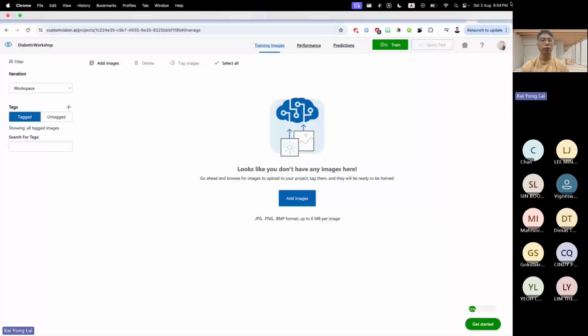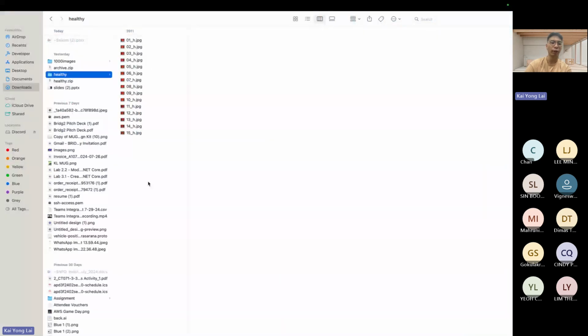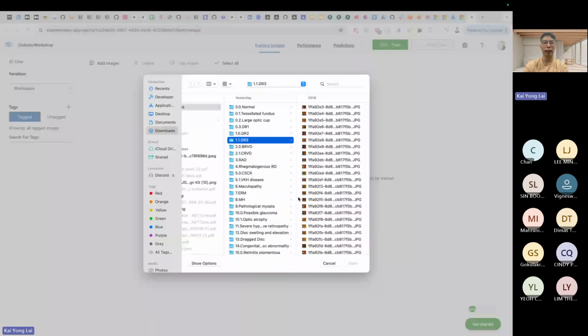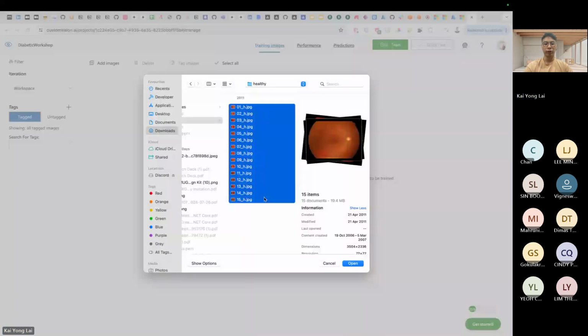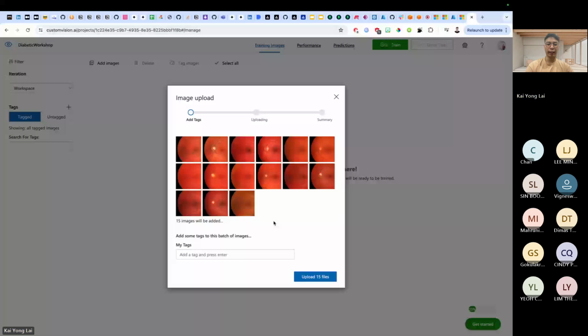Okay. All right. Cool. So I hope you guys already have the data, but if you don't have all of it yet, you can follow once you have it. But I think the healthy data file is very small, so I hope you guys already have that. So the first thing we are going to do here is put in our healthy eyeballs data. So just unzip the zip file, then place all of the healthy eyeballs data here. Okay, so you can see once the images are added, we are going to give it a tag. This tag will serve as the identification of the class.